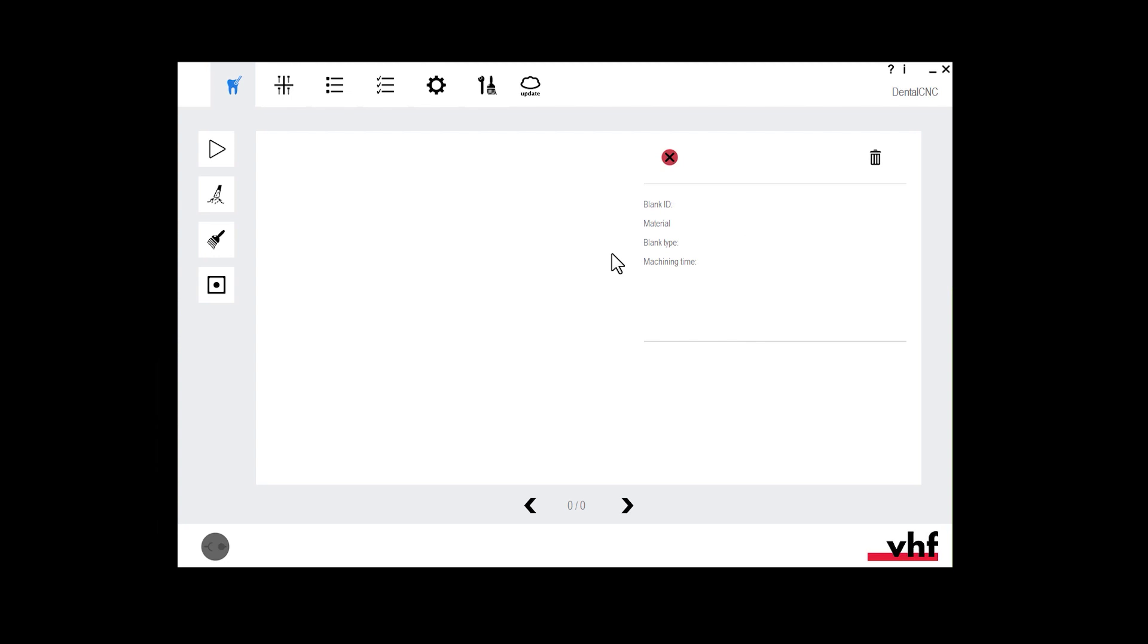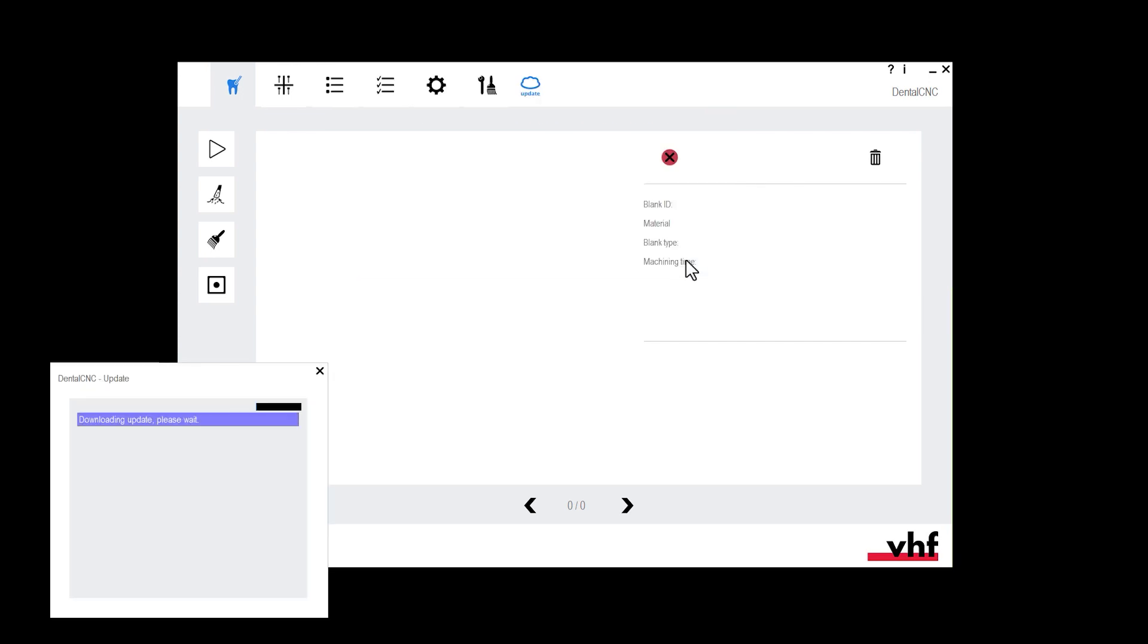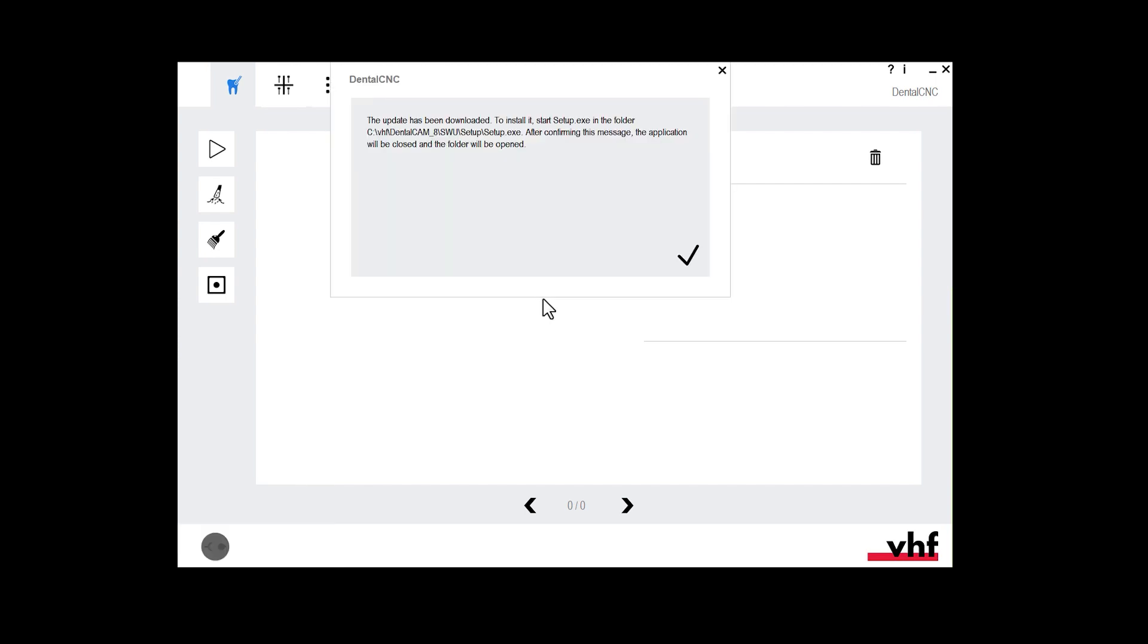To do this, open DENTALCNC. Select the update icon. Confirm the message. DENTALCNC downloads the update. Confirm the message. DENTALCNC closes.